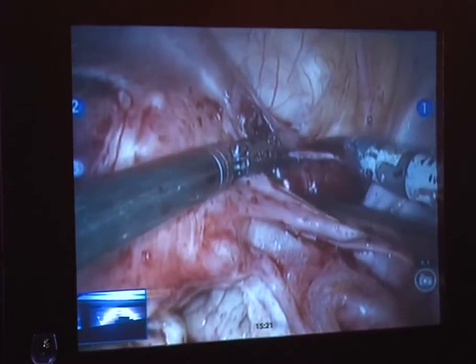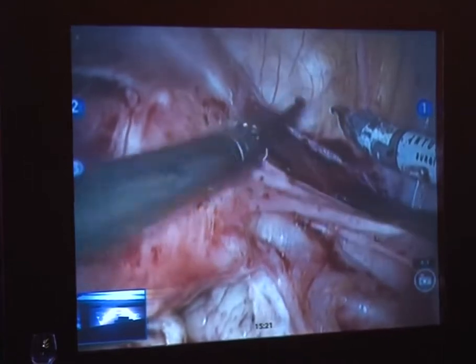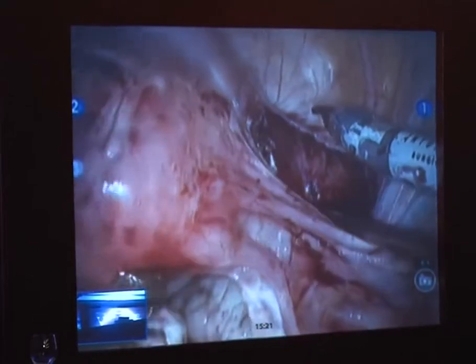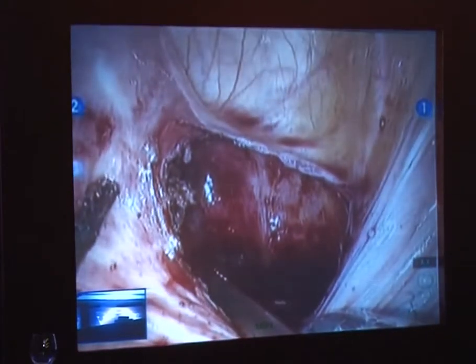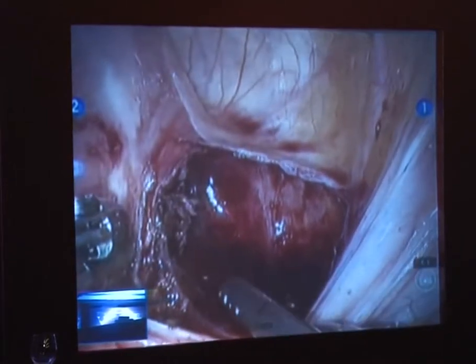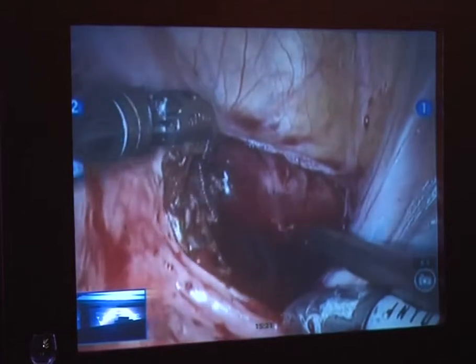Can you move the uterus? We're going to double check this. This is why an MRI is helpful. When you have doubts, you can always look with the MRI. Have you been using the intra-abdominal ultrasound probe from Aloka with the tile probe? I have not, because I always get an MRI, so I've never really had a need for it, because I can localize everything with the MRI.